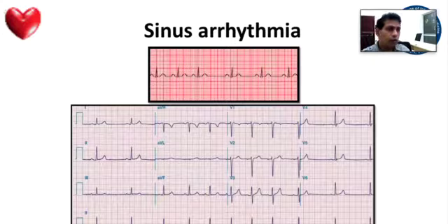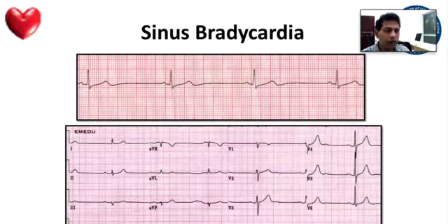Now this is sinus bradycardia. In an online presentation, I don't want to ask questions. I can see more than about 650 people are there, so no point in asking a question.